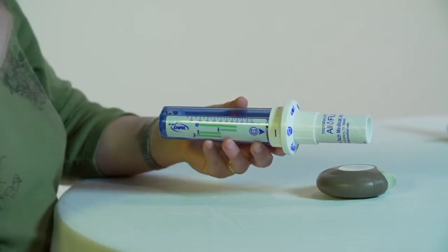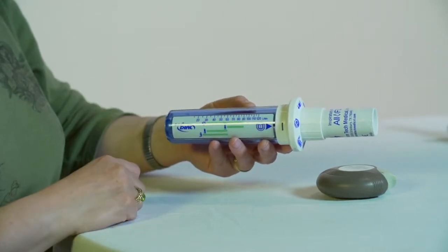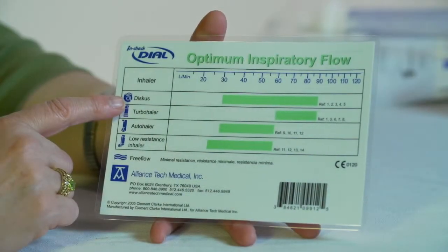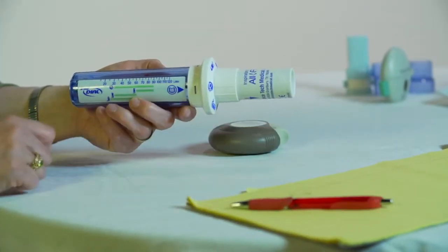The range for the different devices is conveniently along the side of the tube, or you can check the card that comes with the device. Record that rate. Repeat all of the steps twice more to ensure that these results can be duplicated.